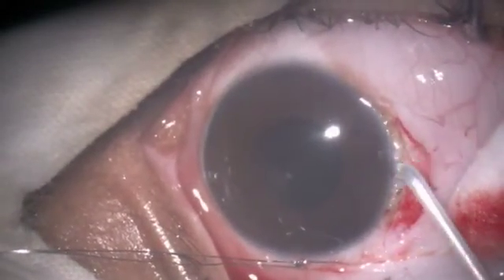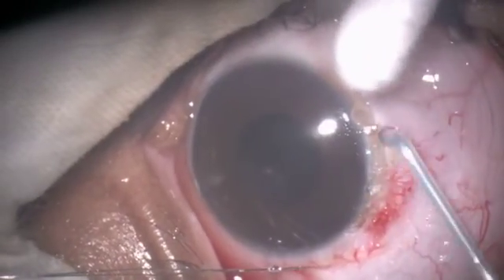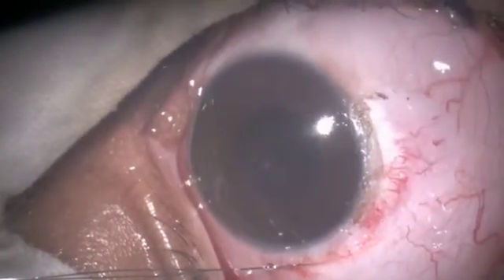That stops bleeding at the same time and the field is perfectly cleared. A contact lens is placed and we wait for the healing.